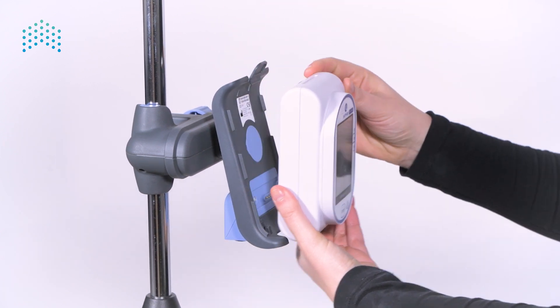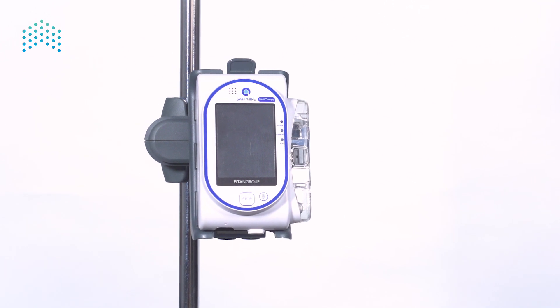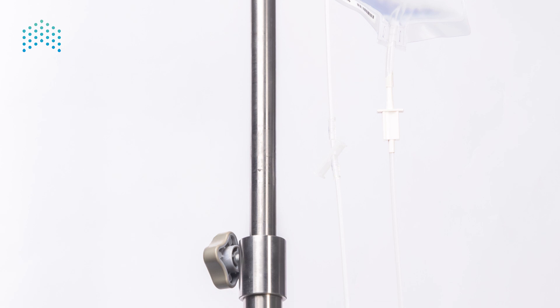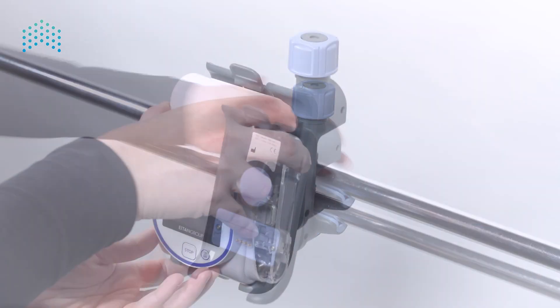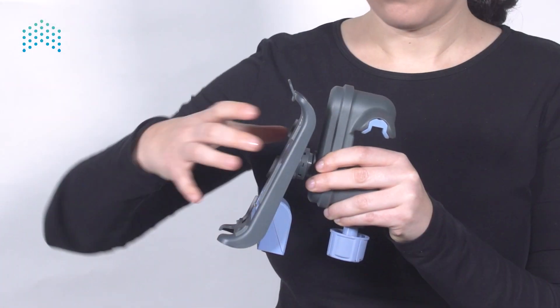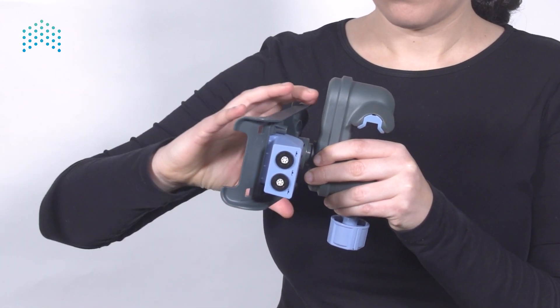The cradle is built to accommodate the pump standing upright regardless of the surface it is attached to — vertical like an IV pole, or horizontal like a bed rail. Change the mini cradle angle by pulling the cradle from its base and rotating it to the required angle.